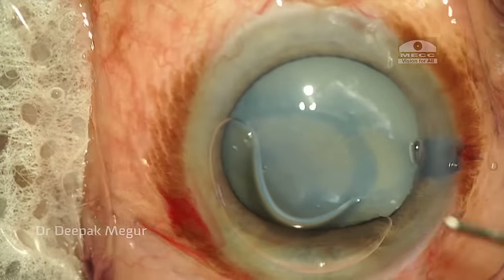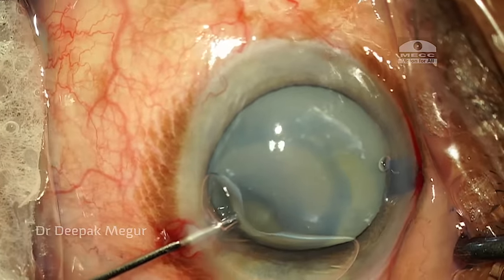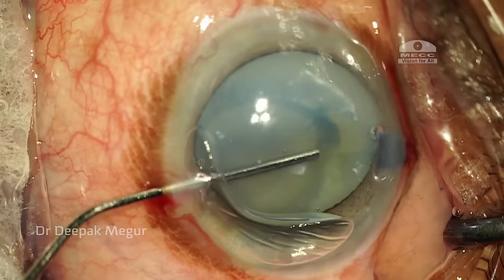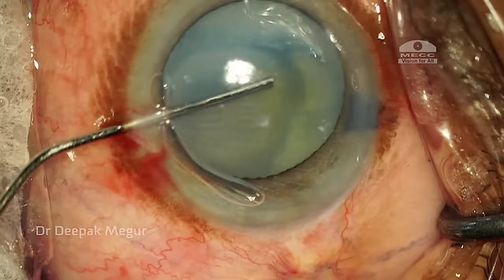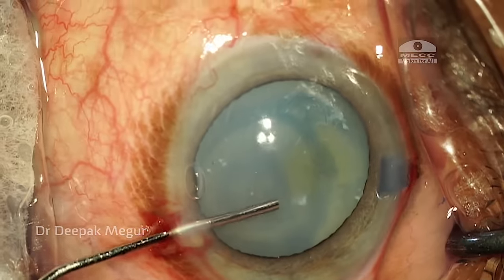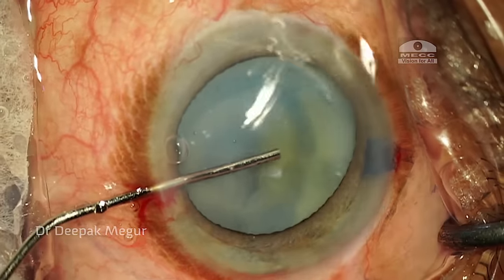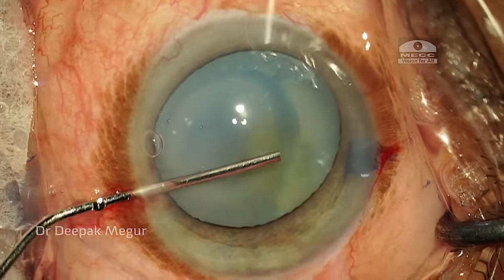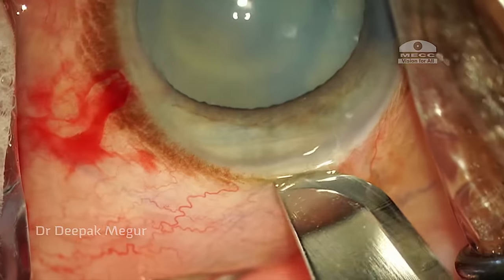My strategy now is to change the angle of attack. I am injecting OVD from the opposite end. I am able to push the lens back, but I can clearly see there are areas of calcified zones which are very suspicious, and I am expecting them to pose problems when I am performing the capsulorhexis.